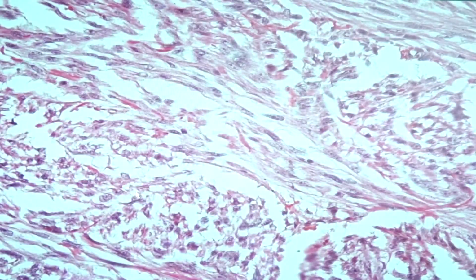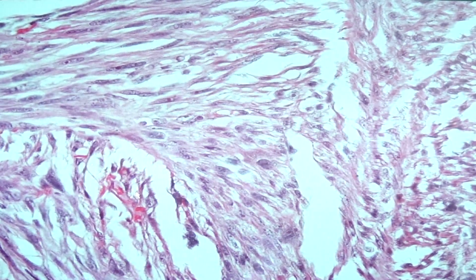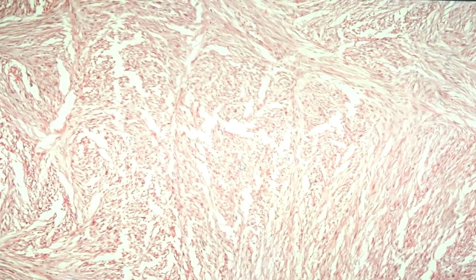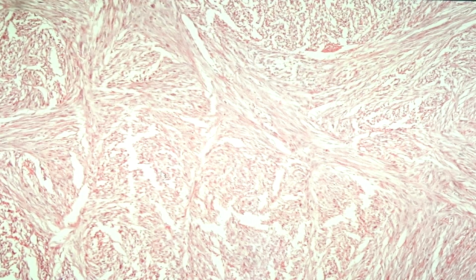Again, if you look at the high power magnification, you would see the presence of atypical cells. Here you have pleomorphism and prominence of the nucleoli of these cells. This would be positive for vimentin because this is a mesenchymal tumor. This one has what you would call the herringbone pattern.